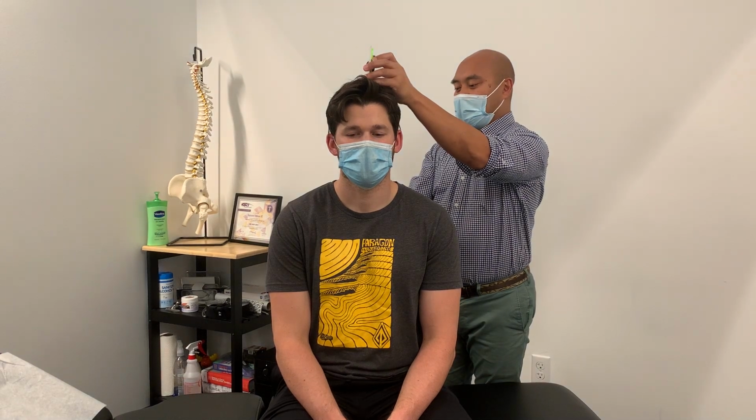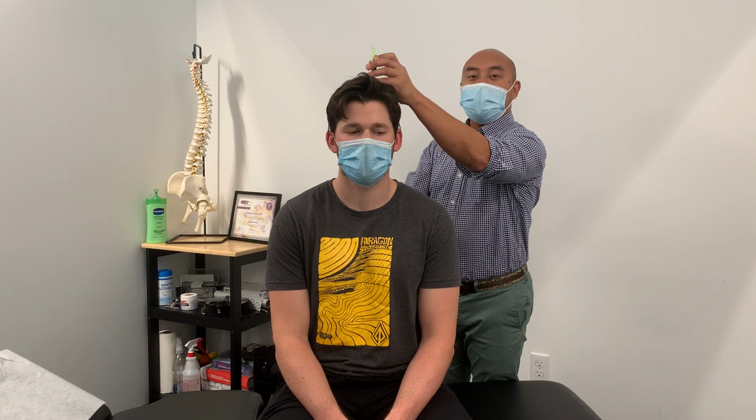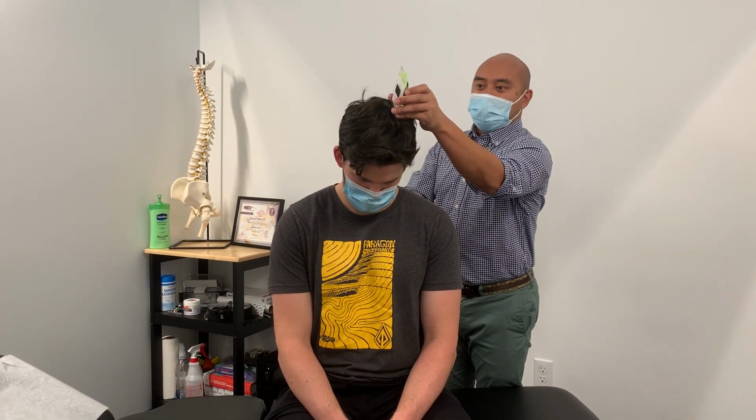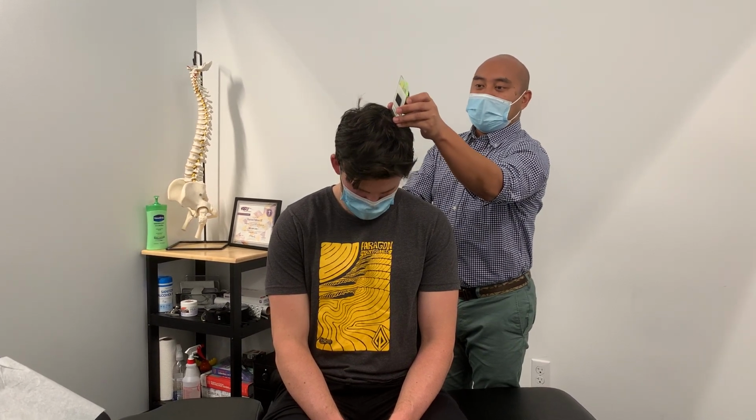and 1 at T1. I'll zero both out before we begin, and I'll have the patient simply bring his chin to his chest. I'll note the range of motion, and he'll go ahead and reset, and I'll re-zero out the inclinometers.